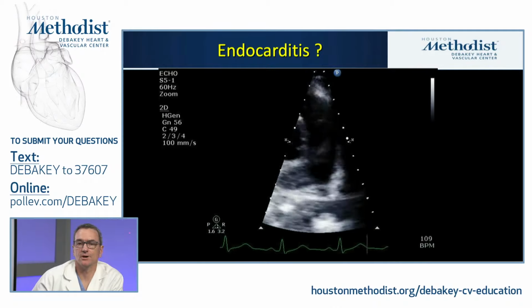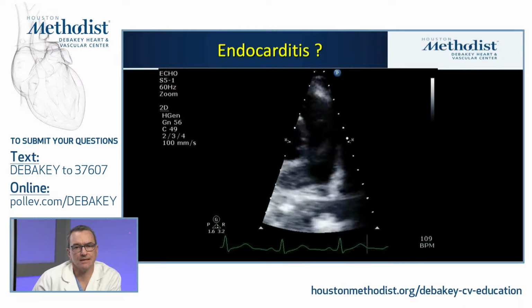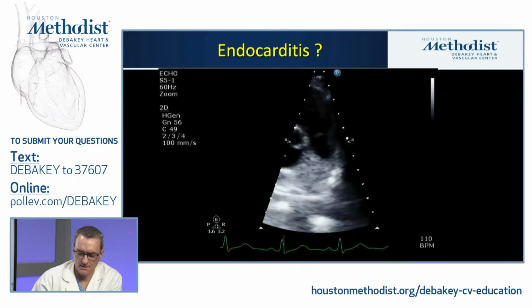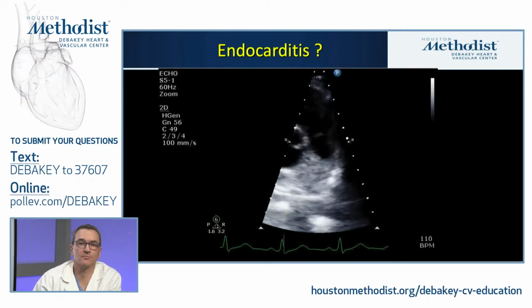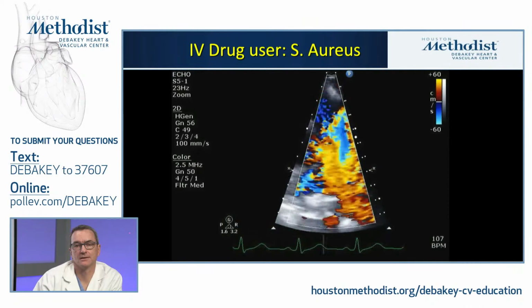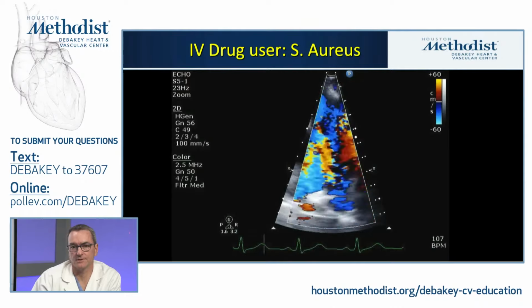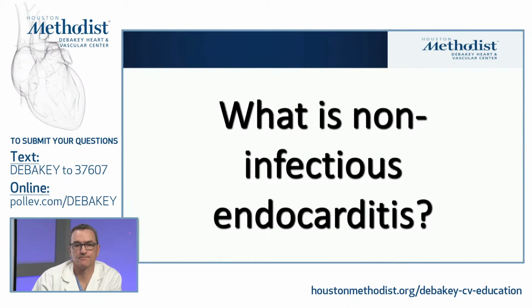This is an important view of the pulmonic valve on the proximal PA. And there's a linear mass there. Now, is it a dissection? That would be odd in the PA, but he doesn't have features of that. It's perhaps oscillating. It's hard to know exactly what that is, but when you look at the company it keeps, and by that I mean the function of the pulmonic valve, you can see gross, wide open PI. So now you have PI with a long linear mass, with a clinical history of an IV drug user and Staph aureus bacteremia. Now you have pretty definitive endocarditis as a diagnosis.